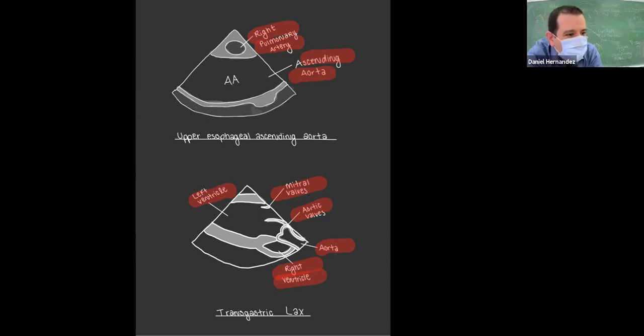So we're in the stomach angling back up, looking back up at the heart. So this is going to be posterior and this is going to be more anterior. It confuses me when it flips. Yeah, me too. Okay, that's all for me.